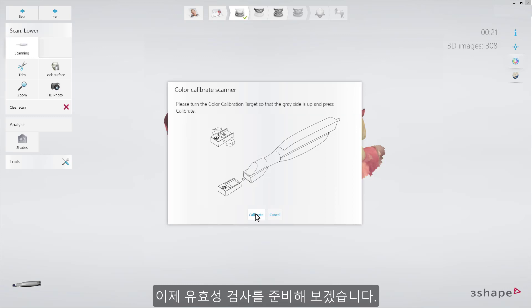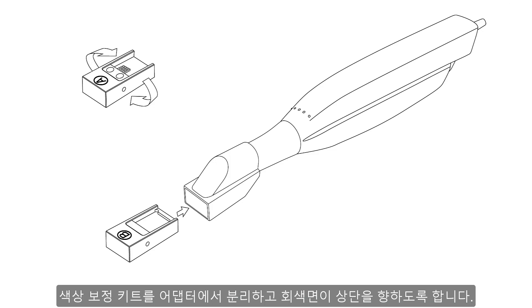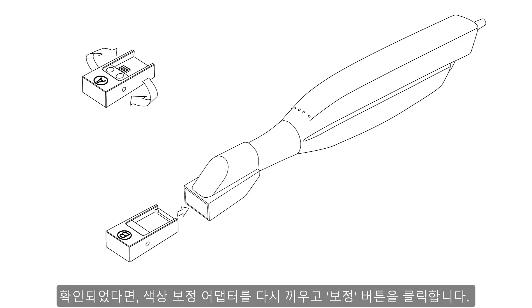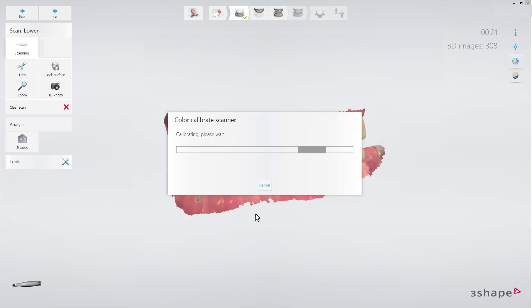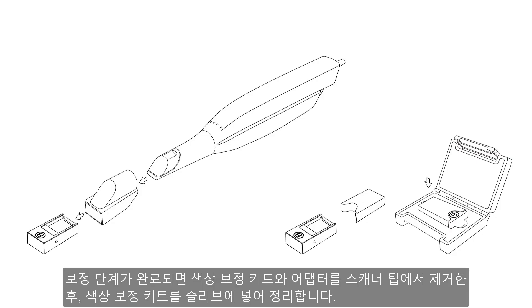The next step is preparing for validation. Detach the color calibration target and turn it over to face upwards on the gray side. While performing this action, make sure that the gray surface is perfectly clean and free of scratches. Reattach it to the color calibration adapter and press Calibrate to start validation — it takes around 30 seconds. Once the calibration process is completed, remove the calibration target and adapter from the scanner tip and put the target into its sleeve.